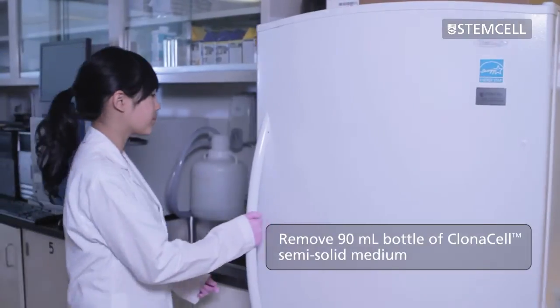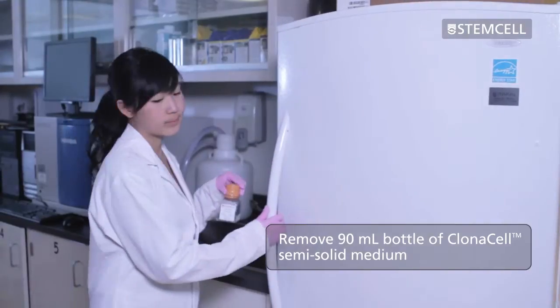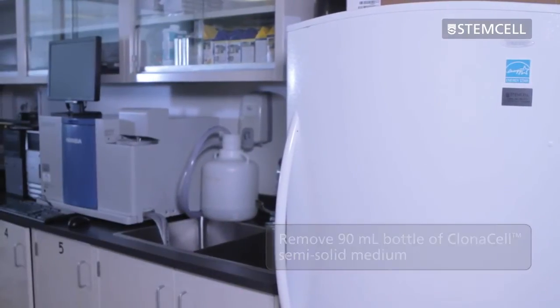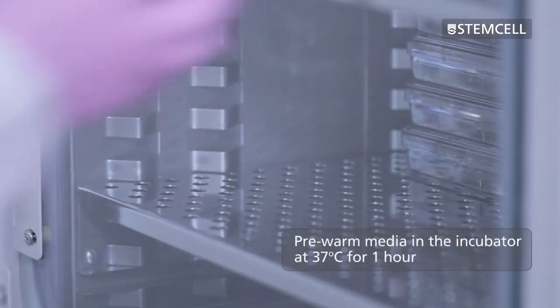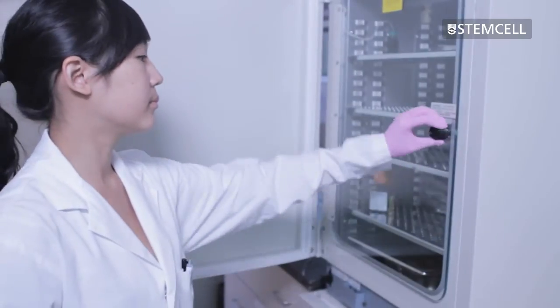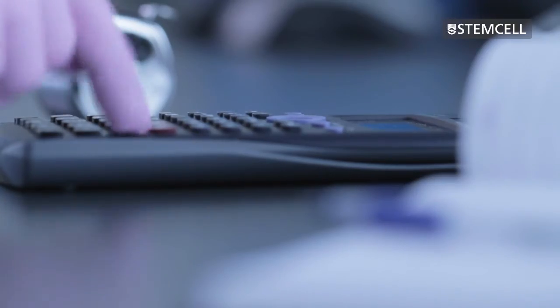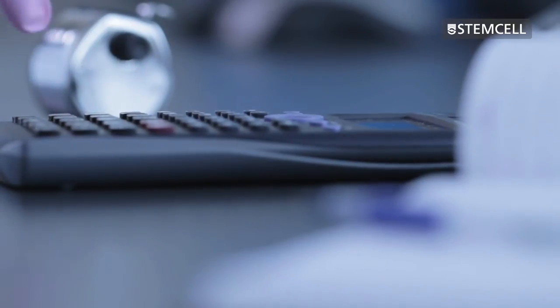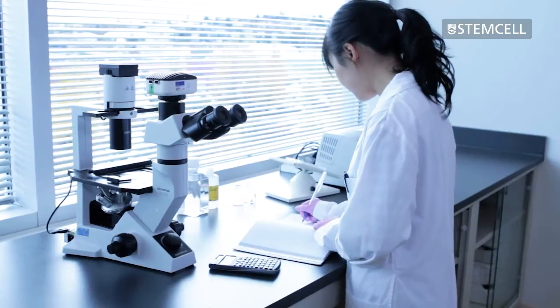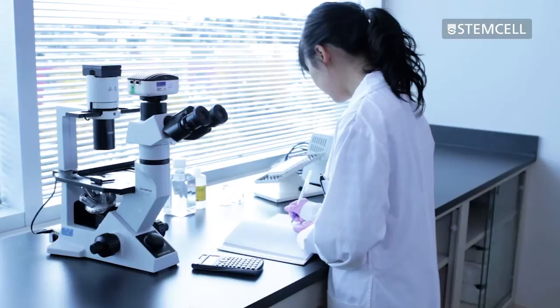To prepare the medium, first remove the 90 milliliter bottle of Clonacell semi-solid medium from the refrigerator. Place the bottle in an incubator at 37 degrees Celsius to pre-warm the medium. Calculate the amount of selection agents and supplements to be added. You can use the same concentration of these components as you would when cloning in liquid medium.